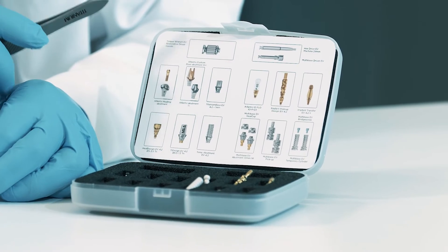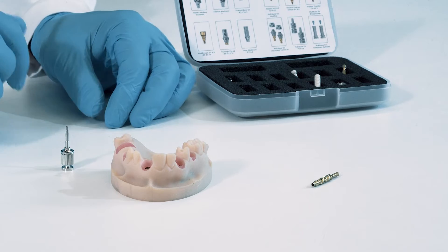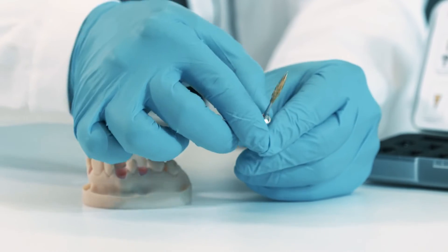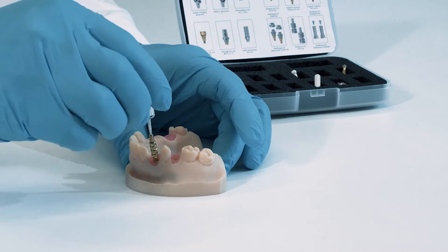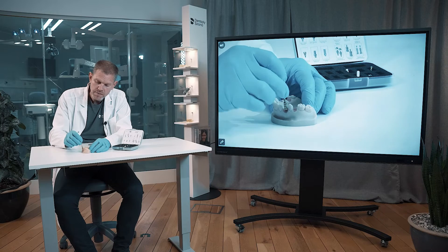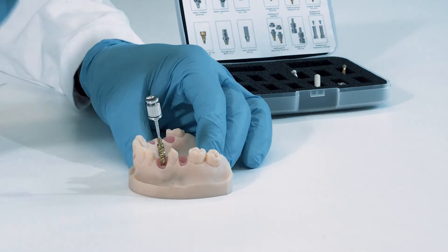Secondly, the implant pickup design also comes in one piece, and preferably you put the screwdriver on this guide pin immediately. You can actually screw down everything in one part, due to the fact that we have a self-guiding function here. Meaning, if you're not correctly positioned with your sleeve, you cannot reach the threadings inside the implant, and it only falls down when it's in its final position — so very convenient.